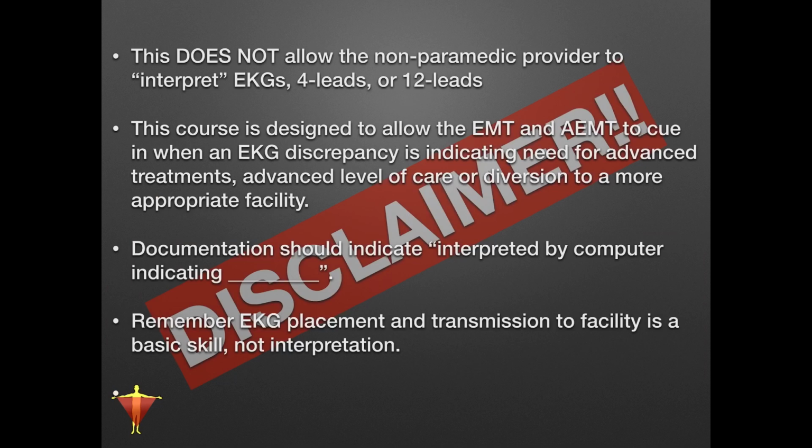Cool. So just so you guys know, we've really only scratched the surface with this EKG interpretation practice that we had. And really, there's a lot more to it. We just wanted to keep it as practical as possible for everybody. If we see something, we want to be able to identify it and be able to say, hey, we need a higher level provider, we need a paramedic, we need somebody else to come identify this. Maybe this patient needs to go to a specialty facility.